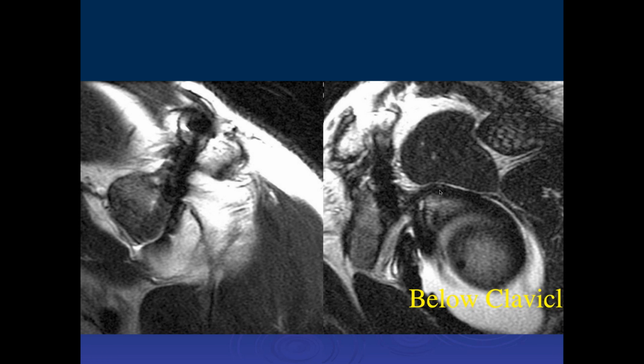Right. So I don't have any examples of a type 6 because I've not seen it on an MR examination. Didn't survive, John. Yeah, that's probably true. So let's see, who's next?